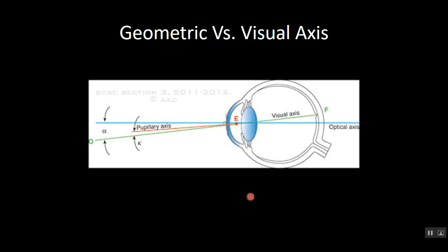Now, another challenge that we face in all contact lenses is the difference between the optical axis of the eye and the patient's visual axis. In other words, if we were to run a point of light through the center of the cornea to the center of the retina, that line will be slightly different than the patient's line of sight based on the temporally displaced fovea.